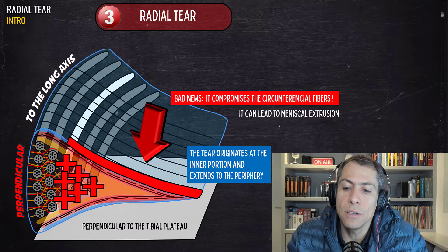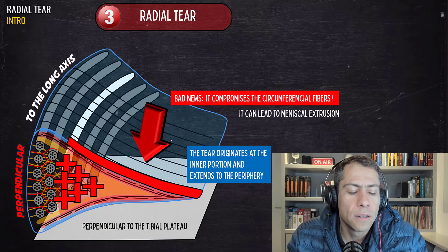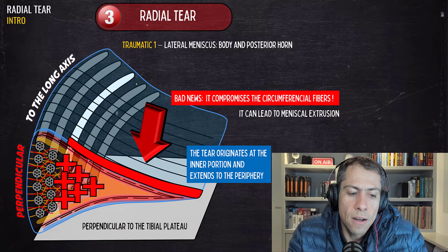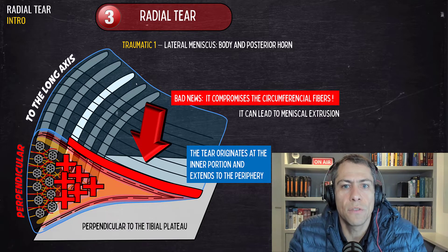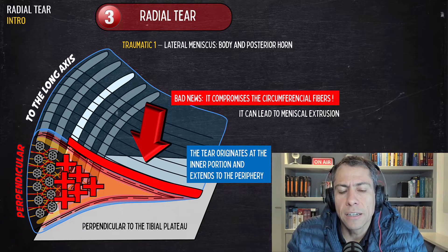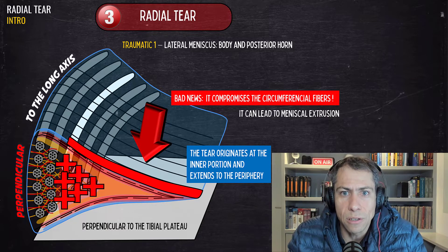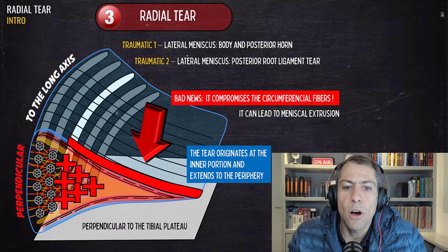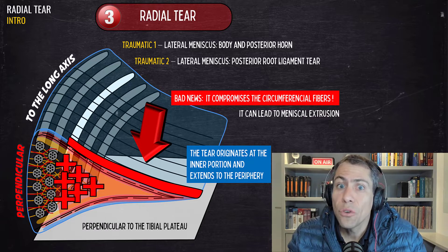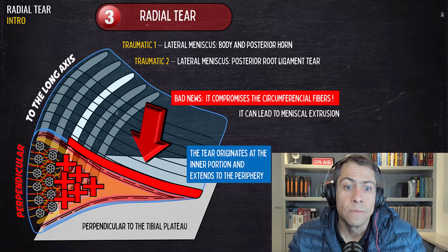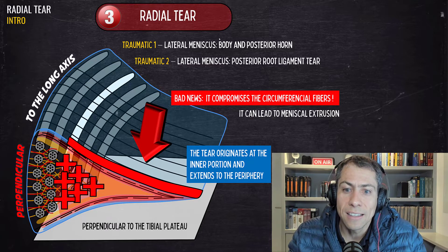This can lead to meniscal extrusion and meniscal insufficiency. There are specific situations and locations where radial meniscal tears commonly occur. One scenario is a traumatic lesion at the lateral meniscus — a radial tear in the meniscal body and the posterior horn of the lateral meniscus. Another traumatic scenario is a posterior root ligament tear of the lateral meniscus, which is associated with ACL tears. Always look for a radial tear in the lateral meniscus in cases of ACL tears.